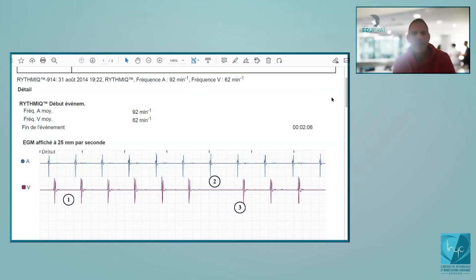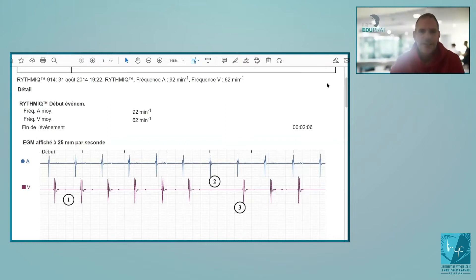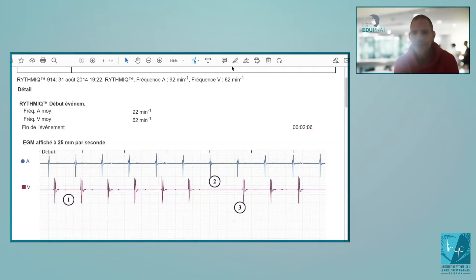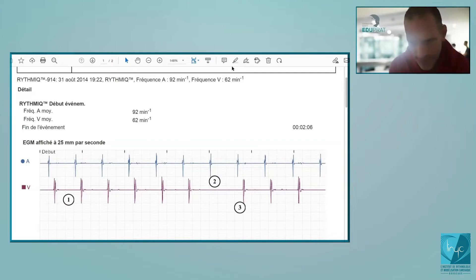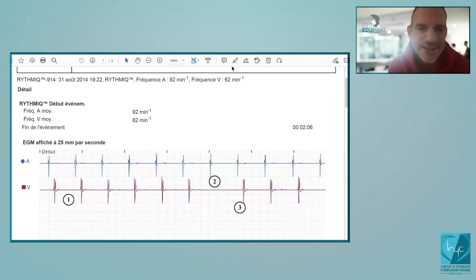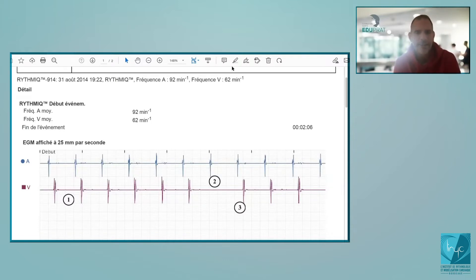Today we're going to discuss tracings recorded by Boston Scientific devices. There are going to be two sessions: the first one about tracings, and then the next one will analyze the different steps of interrogation and programming of Boston Scientific pacemakers.